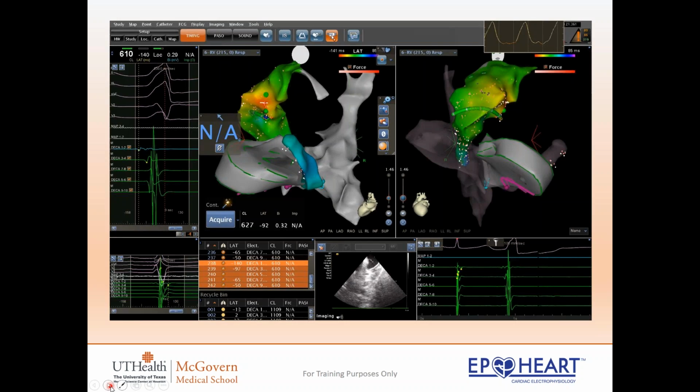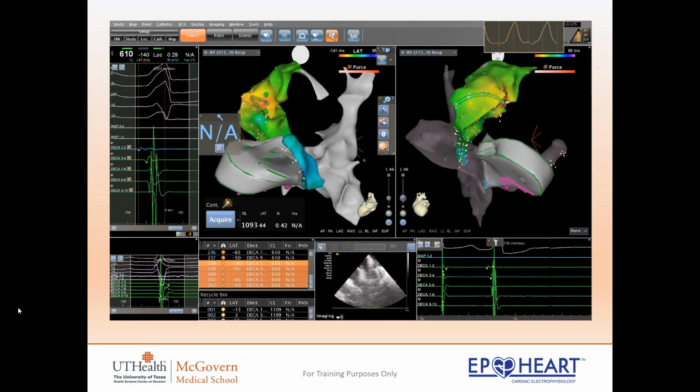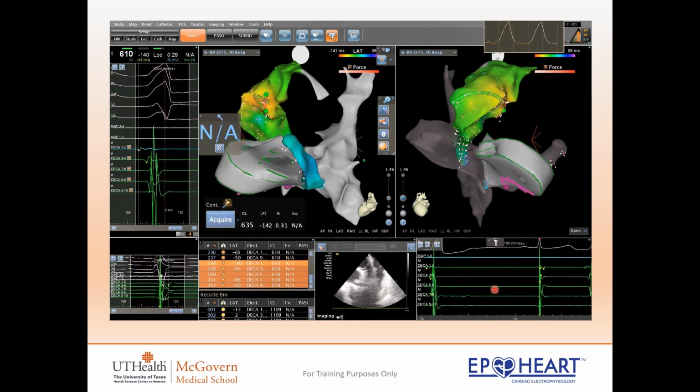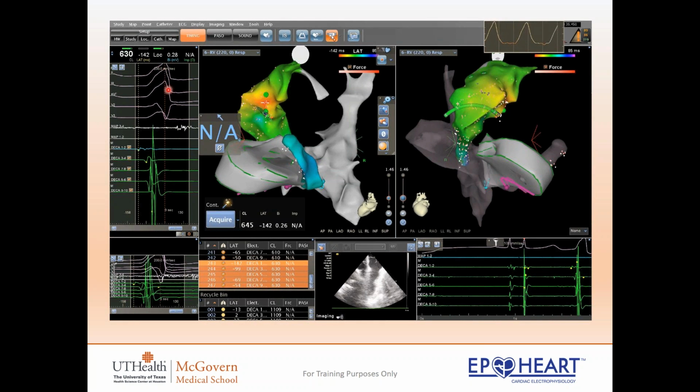What we'll do inside the lab, if you kind of get an idea, look over here at our rhythm: we have a sinus beat, a PVC, a sinus beat, a PVC. So this patient's actually in bigeminal PVCs. They'll take a catheter up, and every time the patient goes into a PVC, they'll take a point, and then they'll look at those signals from inside that heart as to exactly where that PVC is coming from.